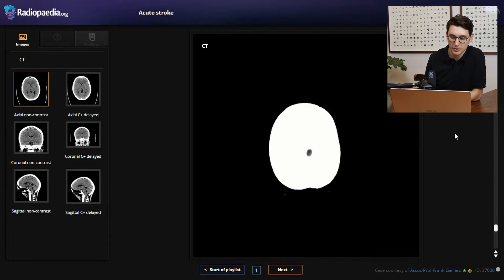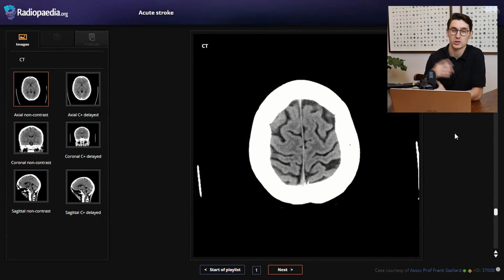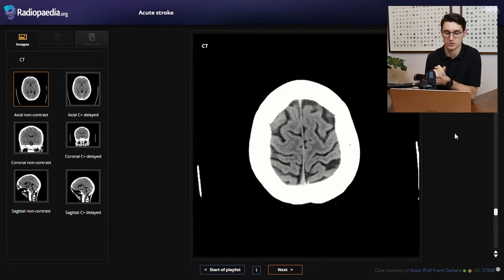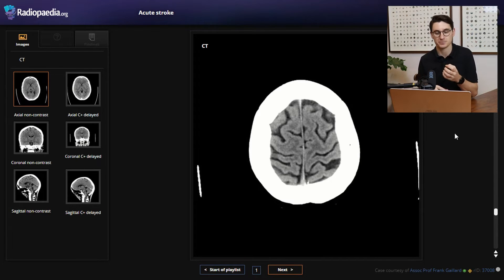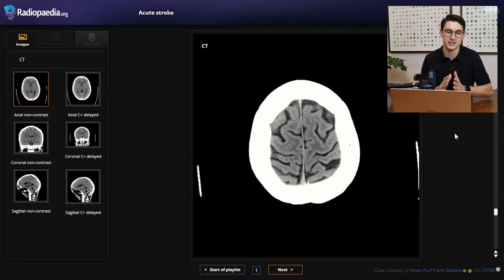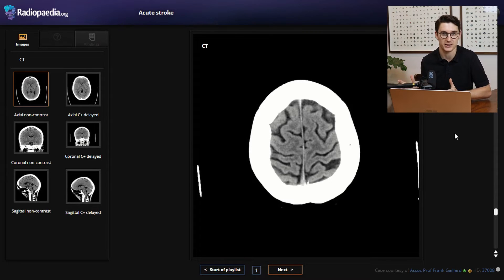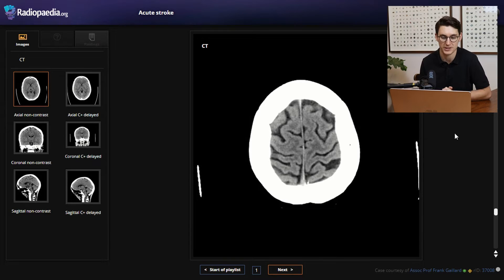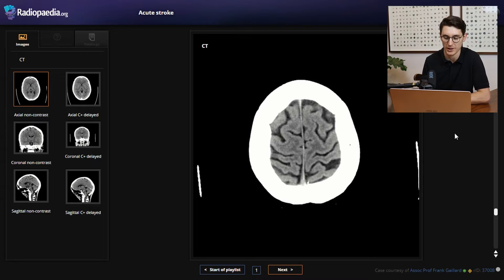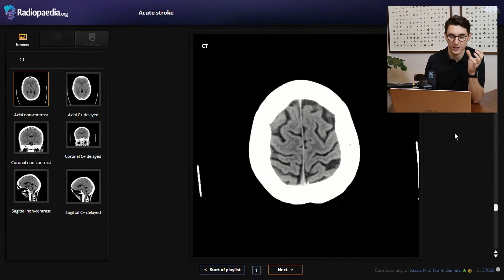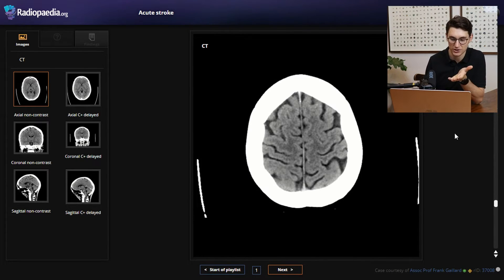Let's start at the top, and I want to point out some things that are really important when we're looking for acute ischemic stroke. The white matter in the brain is a lot darker on a CT scan than the gray matter. It depends on how we window the scan — the contrast between the two increases as we narrow that window. But even on a normal CT scan with normal windowing, we'll notice some difference between gray and white matter. The gray matter should be a lot lighter than the white matter, as you can see here.